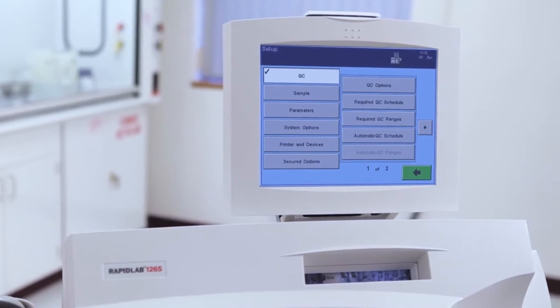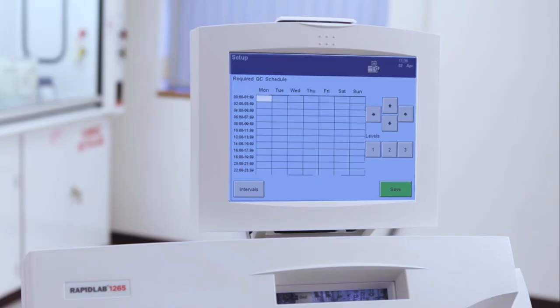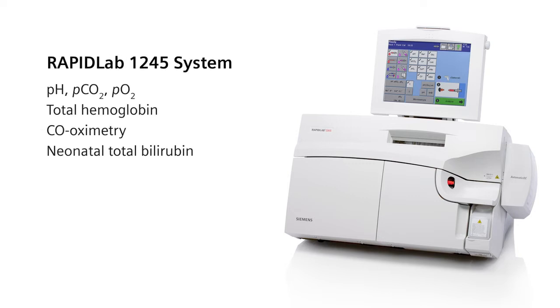Simply program the level and frequency of QC to be run according to your individual hospital QC guidelines. There are four different models of the RapidLab 1200 systems depending on the analytes tested. The RapidLab 1240 measures pH and blood gas only while the RapidLab 1245 system adds full co-oximetry to the basic blood gas panel.